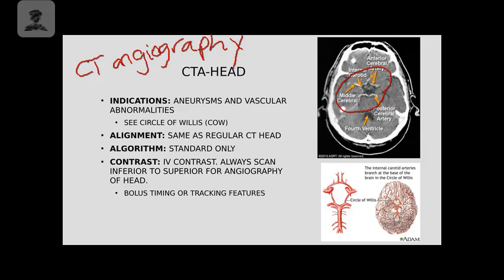For this to work with the CTA, obviously we have to introduce contrast. This is given by an IV, which the patient, if they're coming from the ER, likely already has in place. You can just connect your tubing to it, or you may have to start an IV if they're an outpatient. With this, you'll get very good at IVs. And I'm going to tell you right now, in the beginning, you're not going to be good at IVs.